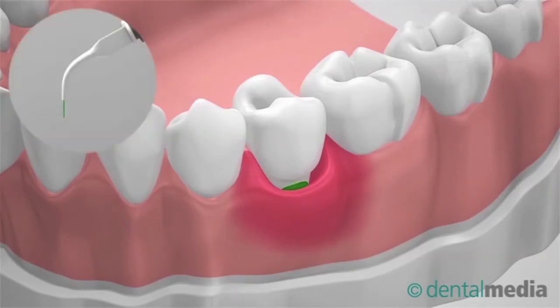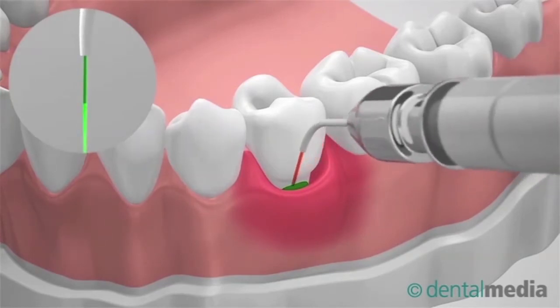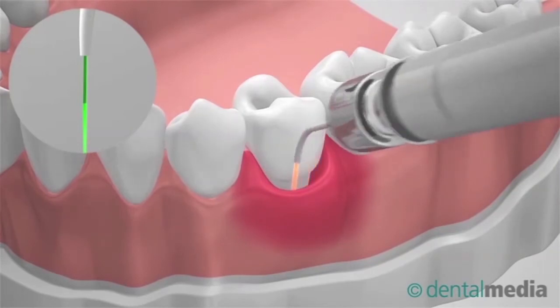A concentrated laser beam is used for ablating inflamed tissue in small areas and in a precise manner. This avoids accumulation of new bacteria and accelerates the healing process.